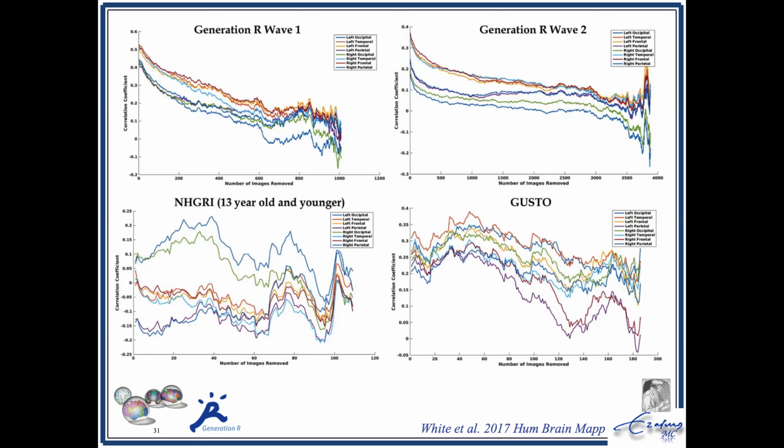I'm not saying it's wrong, but this is the first time I've seen it used. So tell me what the assumption is. Here you're using the correlation between, say, median thickness in the left parietal ROI and the gradient score your algorithm computes, right? So that means you're taking the thickness values in these ROIs as a proxy for the quality of the structural MRI, which is an input to FreeSurfer. Or am I getting it wrong? The gradient measure is not in the brain. It's outside the brain. Right. It's from the edge of the head to the air on the outside.